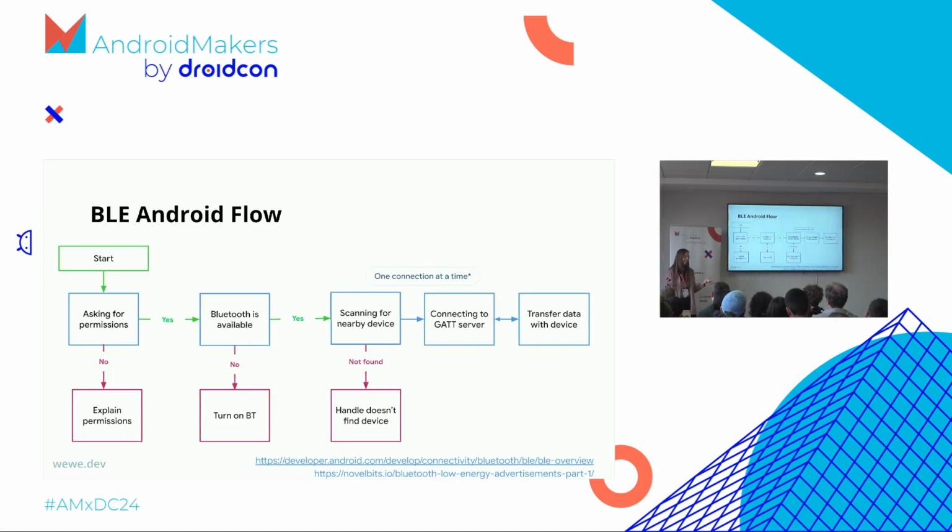So imagine the case where the user has a stethoscope, the phone is connected with this stethoscope and performs an examination, but we didn't drop the connection because the user might want to repeat this examination in 1 minute, but decides, okay, I will choose another phone. So the stethoscope won't be found, and here we have this situation: handle device not found. We need to inform the user and explain everything, which is not so easy.